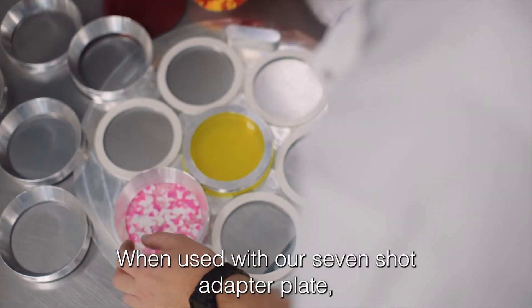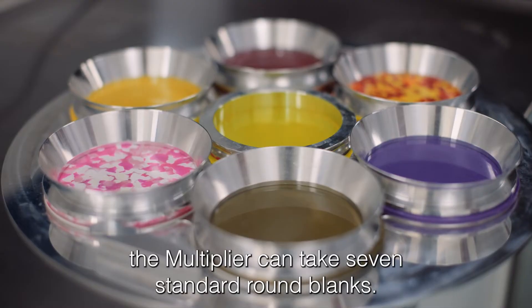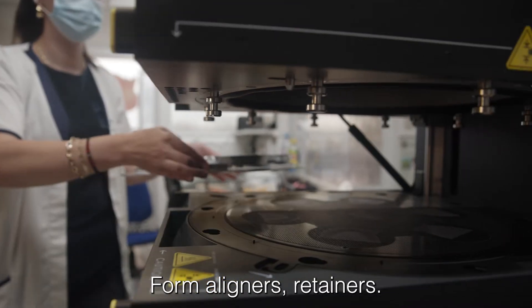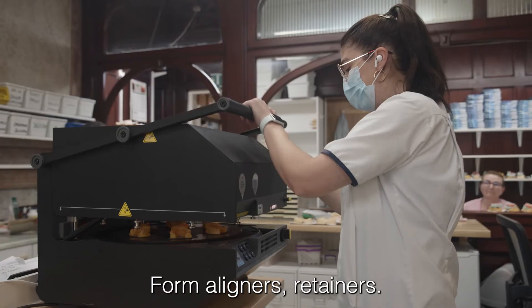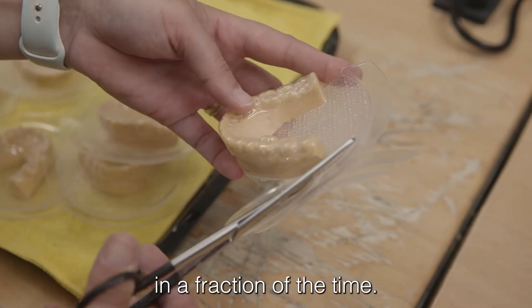When used with our seven-shot adapter plate, the multiplier can take seven standard round blanks. Form aligners, retainers, whitening trays, and mouth guards in a fraction of the time.